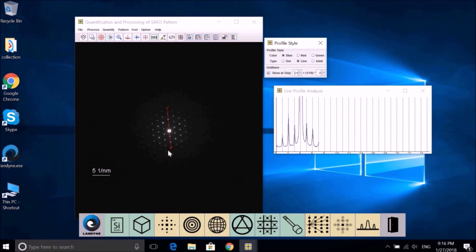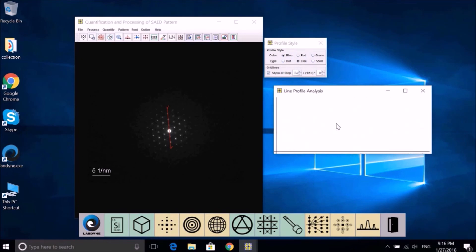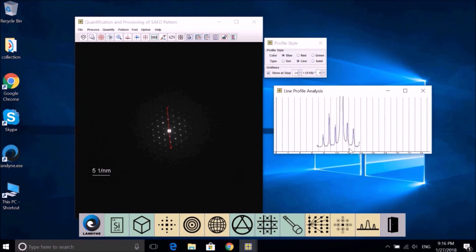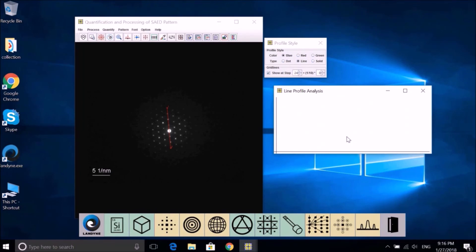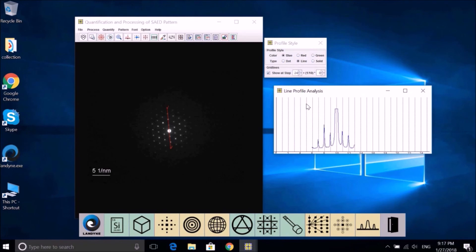If this is non-periodic, we can also measure the profile. We can show the profile in different colors. If you hold the mouse left button, then you can move the profile to the center. And you drag down, you can adjust the overall height of the peaks.